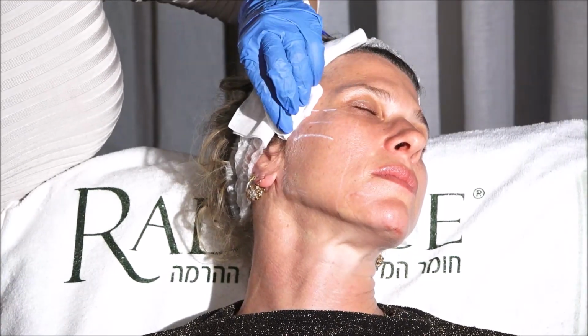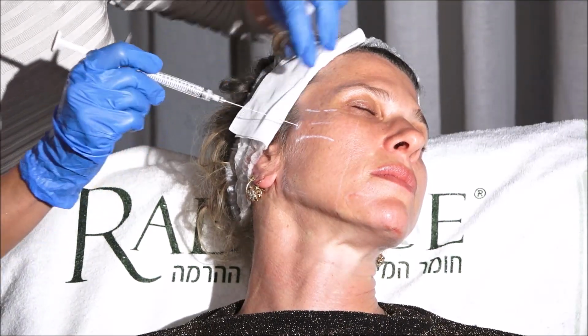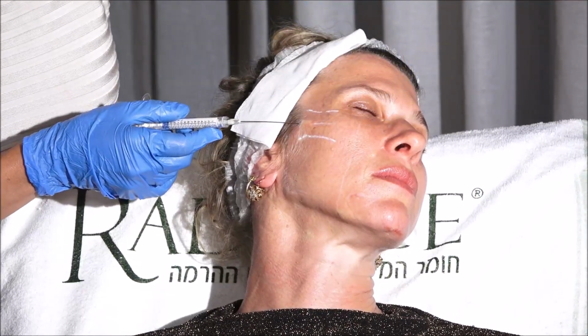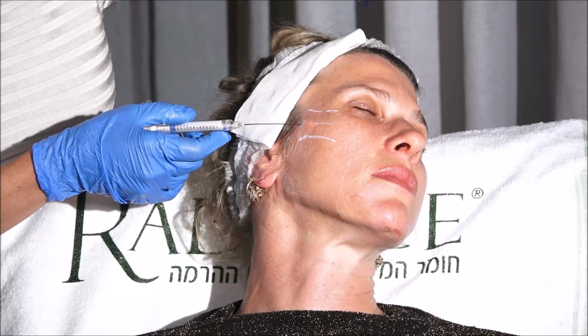So this is Radiesse dilute 1:1. My goal is a subdermal approach. I'm going to use half a syringe of the solution, 1 syringe per side of this whole solution, half a syringe of non-dilute per side.